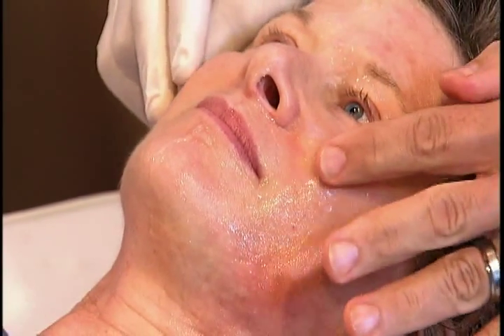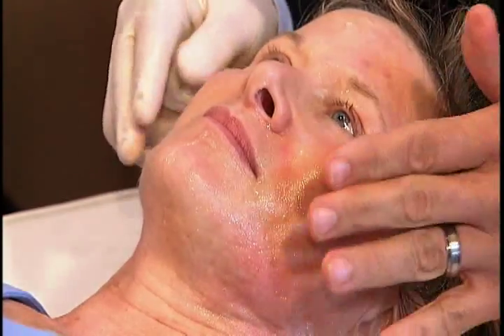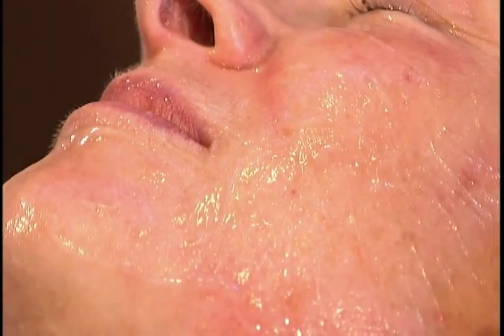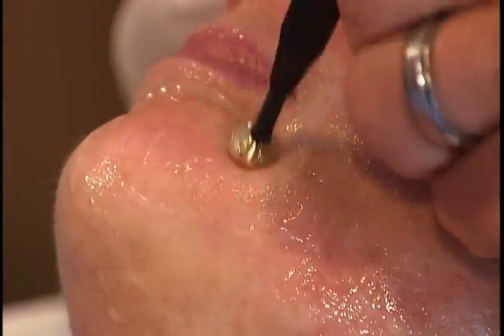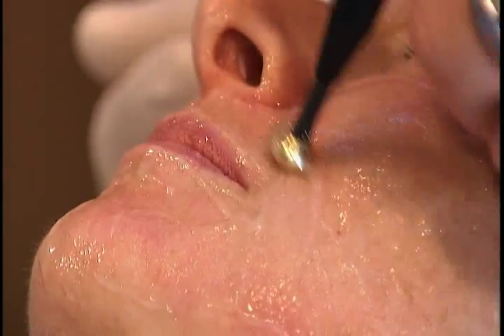And again, she's got this nice soft fat pad, but not too soft. So I'm going to, again, help push that up. I may heat over it a few times, but I don't want to lower that too much for her. All right, so about now is when I'm actually seeing it contract as I go over it. So you'll get to a point with every patient where, as I go back and forth here, I'm literally seeing it kind of shrink under my probe, getting even tighter. And so we know we've gotten beyond the point of initial contraction, and now we'll see how long it takes to get to the point of minimal further contraction.